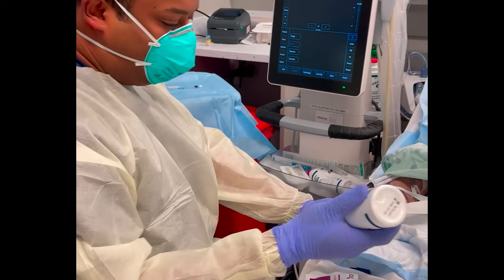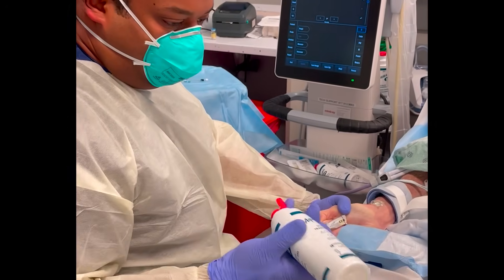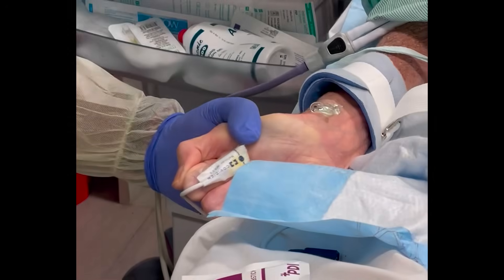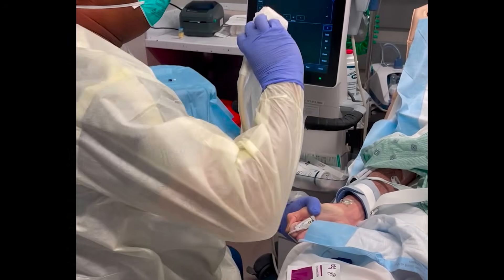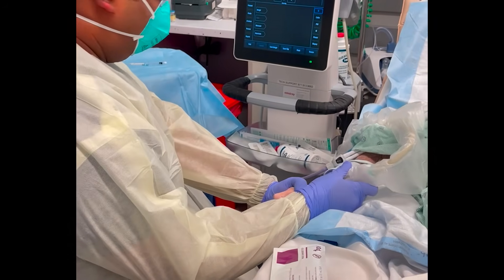To put an arterial catheter in, you need to identify a suitable vessel. With the ultrasound-guided approach, it's a lot easier to use a radial artery than a femoral artery, just because there's less soft tissue that you need to go through.